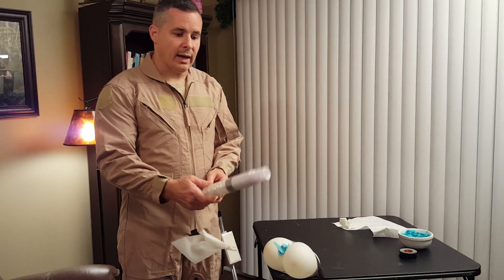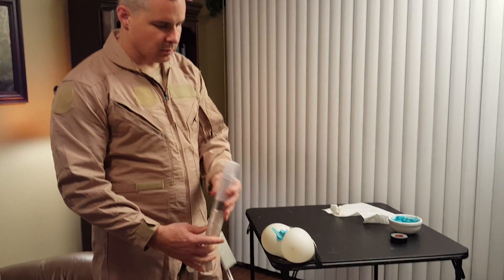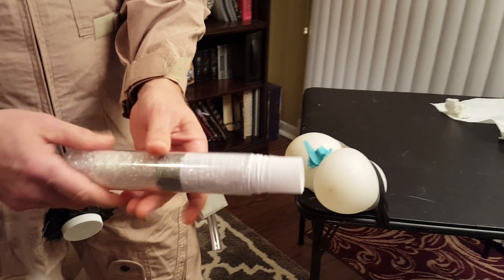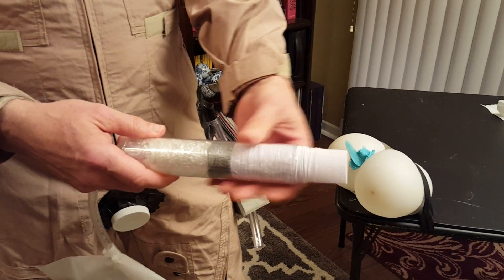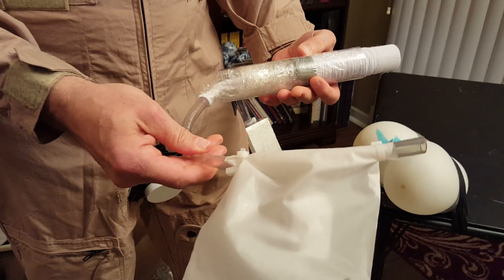This is the perineal hygiene wand. It has a gauze on the end that, when we pull here, the gauze renews. You can wet it or medicate it. And as you pull it out, the sheath covers on the back. There's suction and a suction collection device.